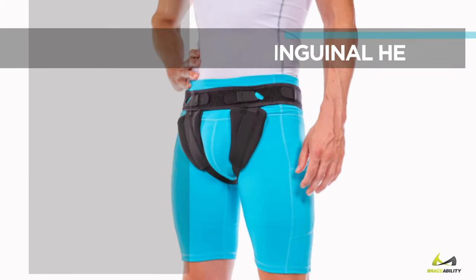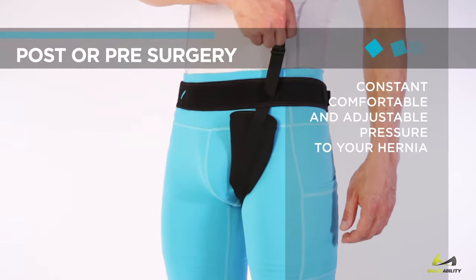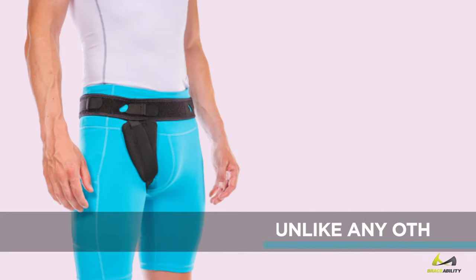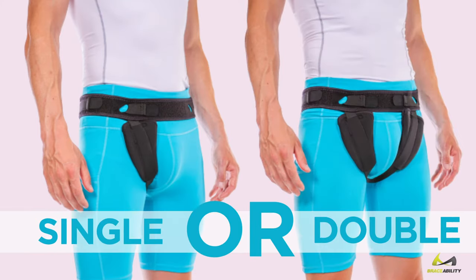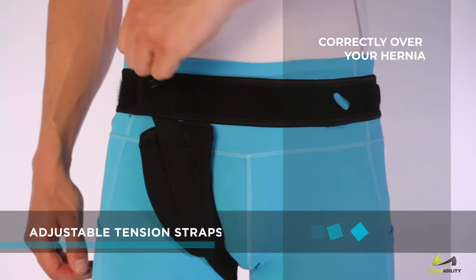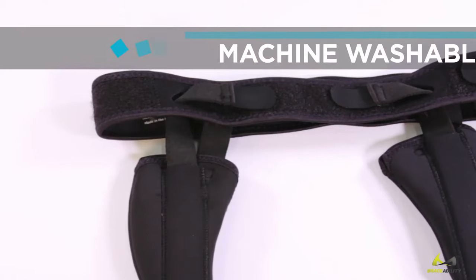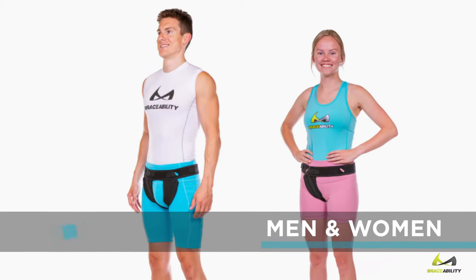Braceability inguinal hernia belt — use post or pre-surgery to provide constant, comfortable, and adjustable pressure to your hernia, unlike any other support on the market. Use interchangeably to treat single or double hernias. Adjustable tension straps allow you to position the anatomically shaped compression pads directly over your hernia. Breathable, machine washable, skin-friendly material fits men and women.